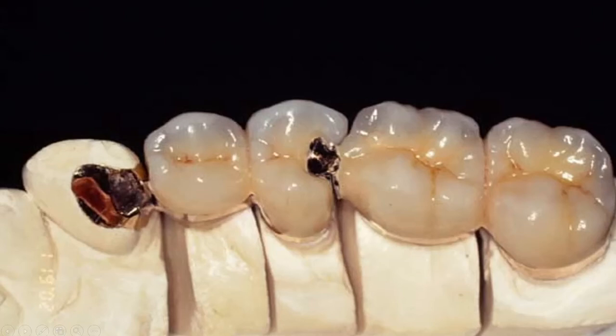هنا الريتينر هو intracoronal restoration اللي هو class 3 inlay. اوكي. وهنا الاباتمنت هذا عندنا شنو full coverage major retainer وهذا major retainer. طبعا this abutment is major retainer element للanterior component of the bridge وبنفس الوقت it is a minor retainer to the posterior component of the bridge. Okay.